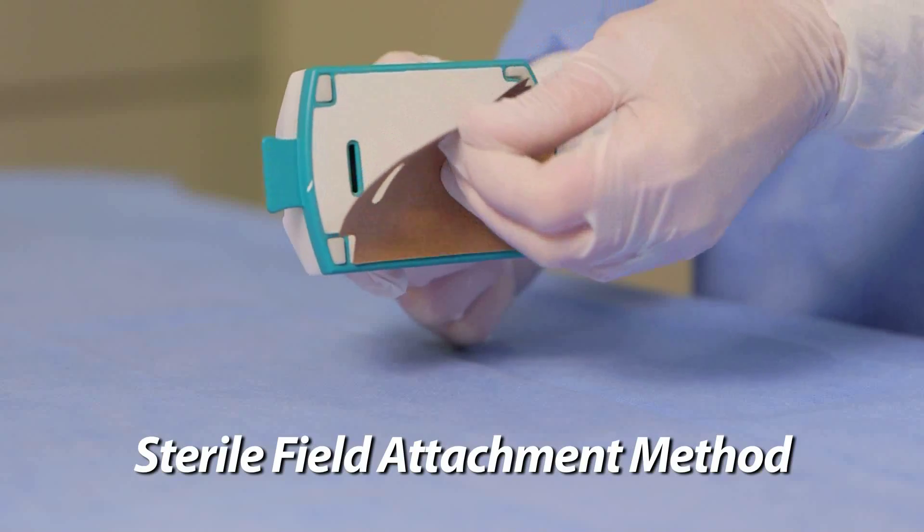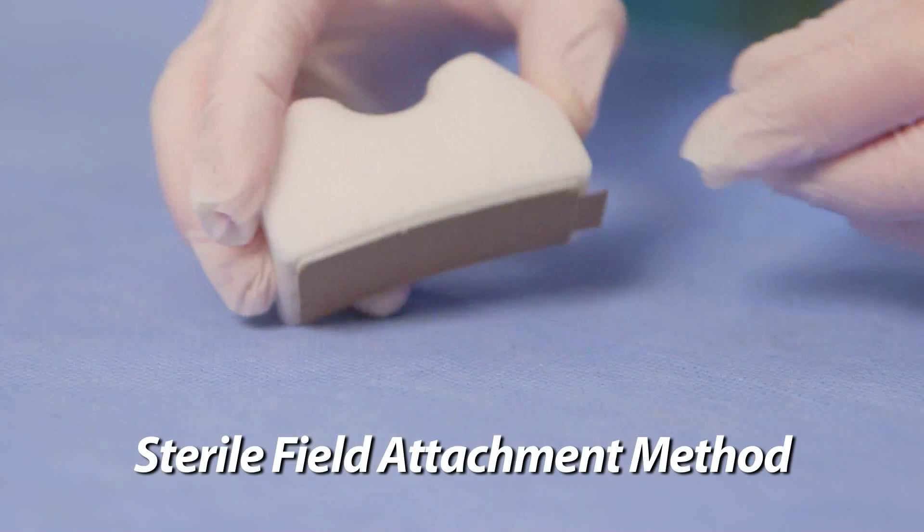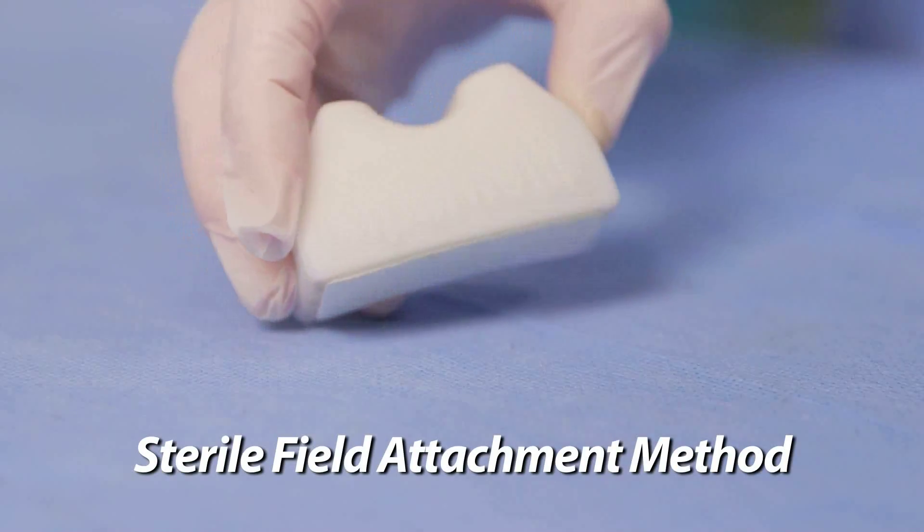If desired, secure both the main unit and scope cradle onto the sterile field by removing the adhesive backing located on the bottom of the unit and cradle.